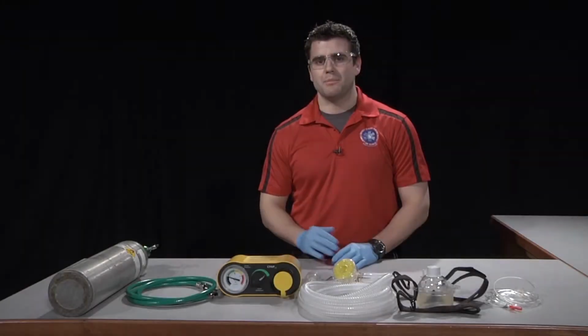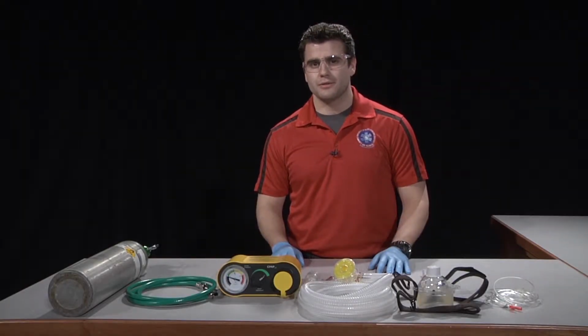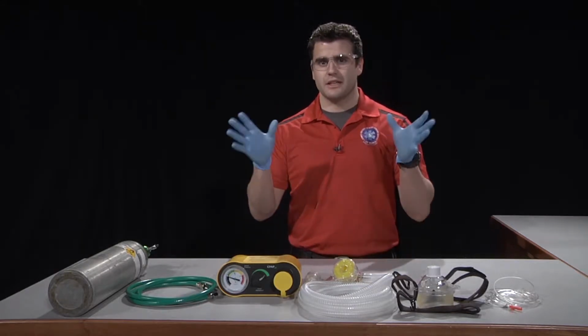This is the CPAP and PEEP skill. Our first step is going to be to take our standard precautions. For this skill, we'll need eye protection and gloves. From there, we want to ensure our patient has an adequate blood pressure. We also want to then sit them in a high Fowler's position to ensure ease of ventilations.